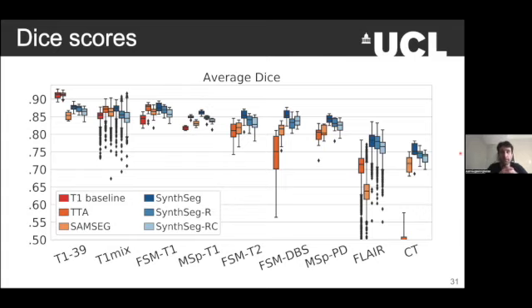And it's also, again, supported by all this evidence from the domain randomization literature in robotics, where they play this type of games as well. So yeah, the idea is that by sampling contrasts that are so crazy to be real, you're essentially teaching the network not to rely on contrast at all, or resolution for that matter.